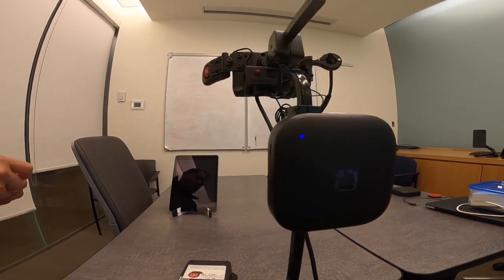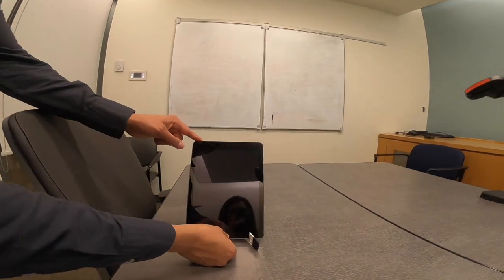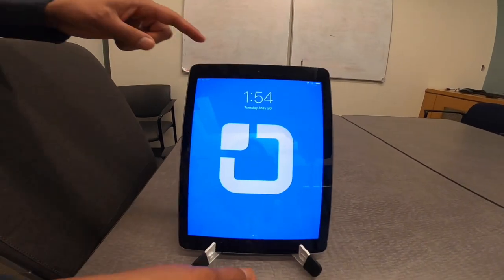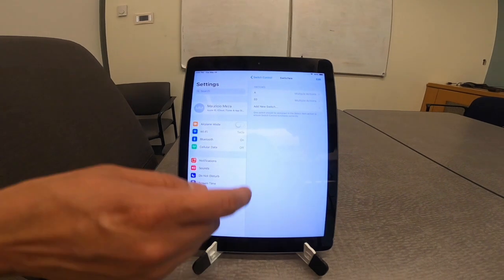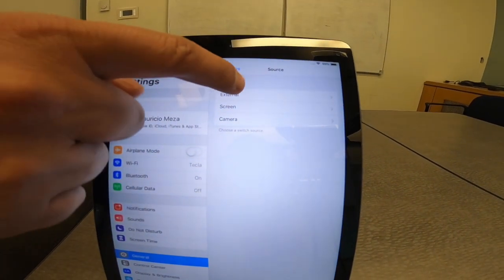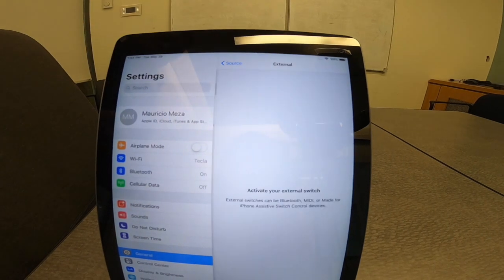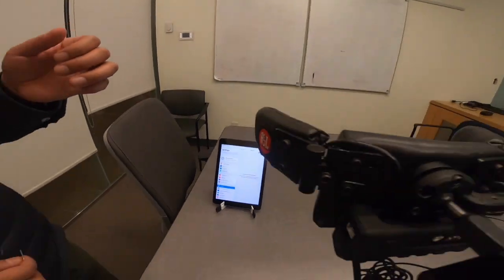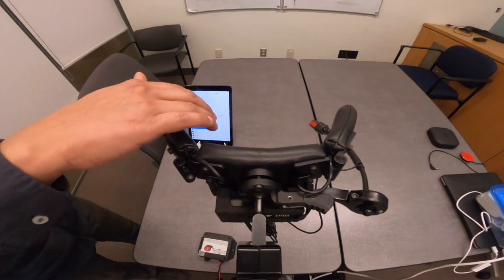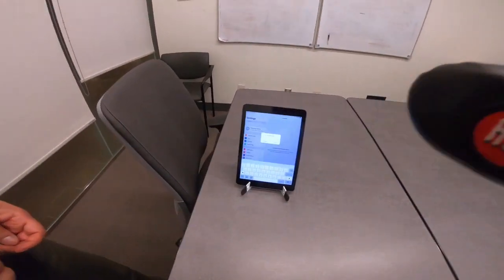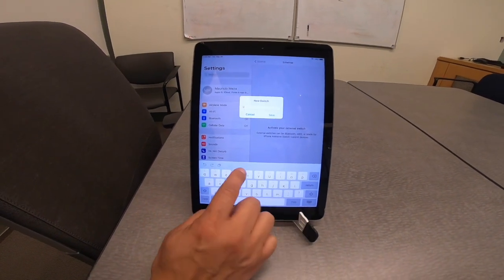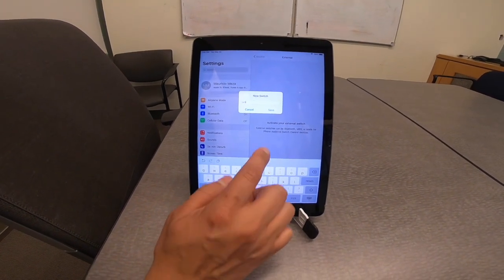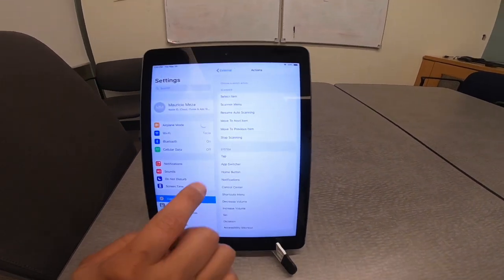Since we are already connected with the iPad, we will now assign the switches of the head array different capabilities with our device. Click add new switch, external switch, then press the switch you would like to program and name it accordingly. For the left side, we will just name it left. Select the setting Move to Previous Item.